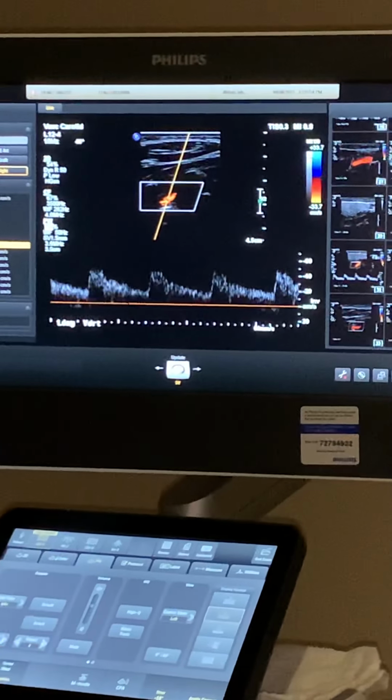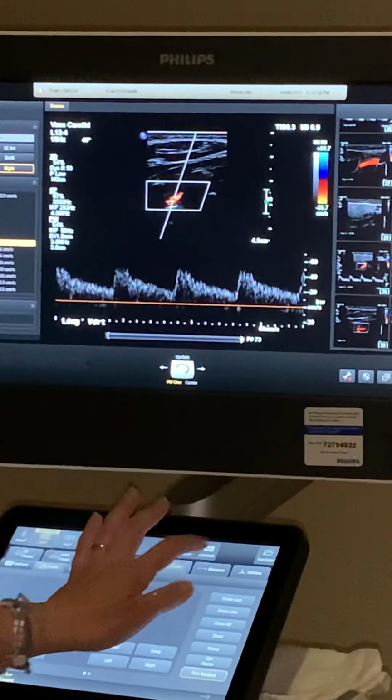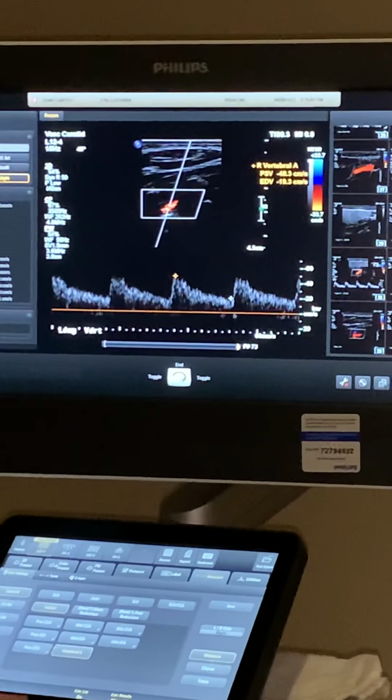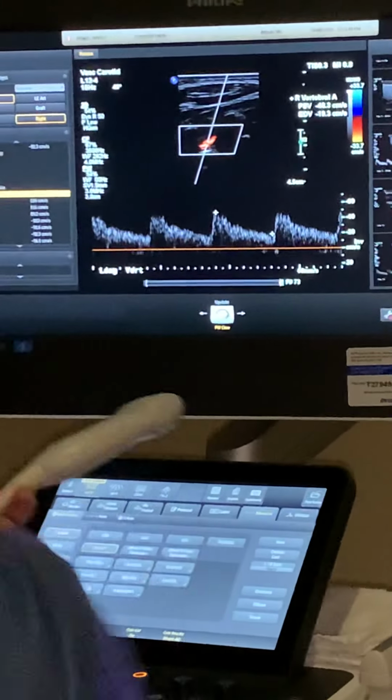Gorgeous. Alright. And get this one put in the package as well. And then she's going to show you how to do the package, and then of course you'll do the other side. Lather, rinse, repeat for the other side. You want to show her how to do the package? Yeah. You got it? Yeah.